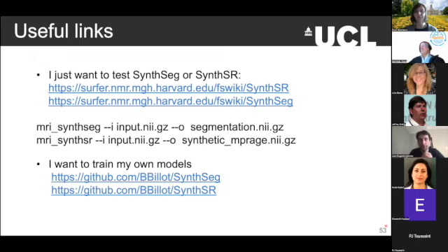Now, if you want to segment the lesions, that can be a bit trickier. And we haven't tried that much, so I will speculate. When we tried, if you just make the lesions another class and just segment, the problem is when you throw in images with lesions, it does great. But when you have images without lesions, it's very trigger happy.